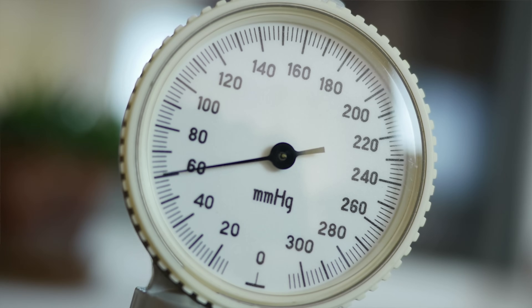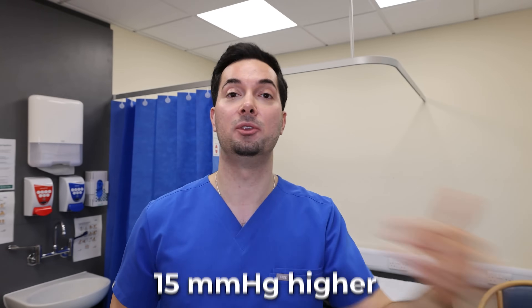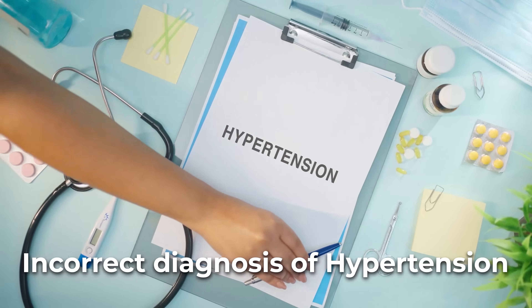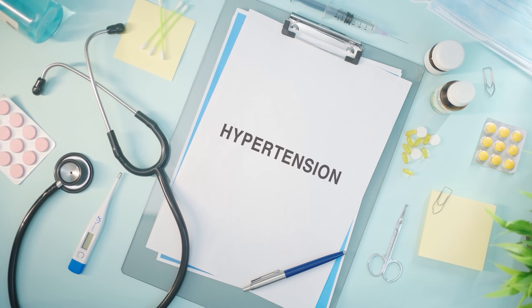I had a patient with this exact issue — he provided seven-day home blood pressure readings that averaged about 15 millimeters of mercury higher than what I was getting in the office. When I asked him to bring in his blood pressure monitor, I noticed the cuff was too small and was overestimating his blood pressure. If I hadn't checked this, it might have resulted in an incorrect diagnosis of hypertension. It's critical that your cuff size is correct.